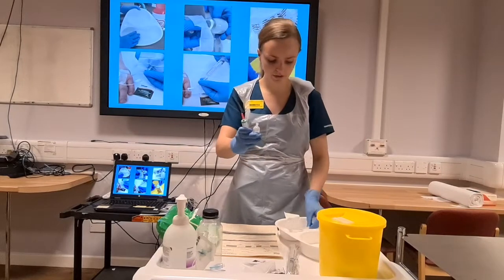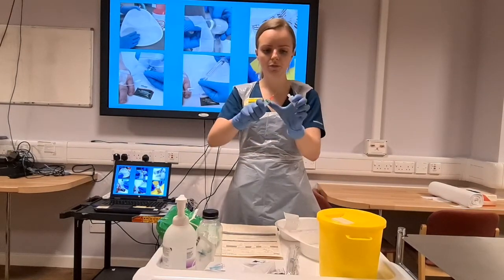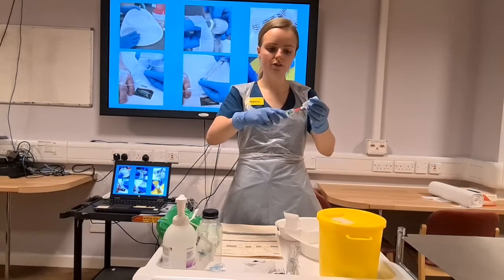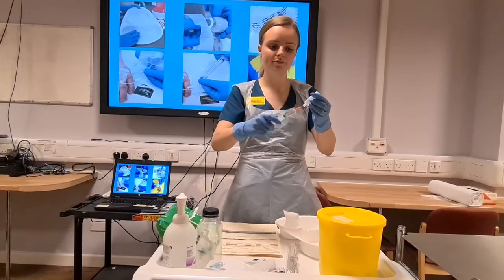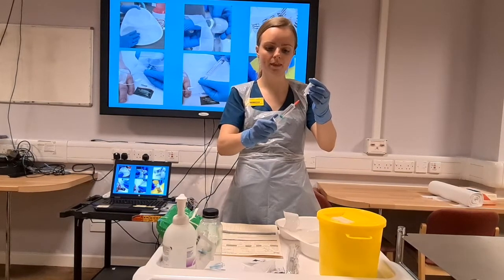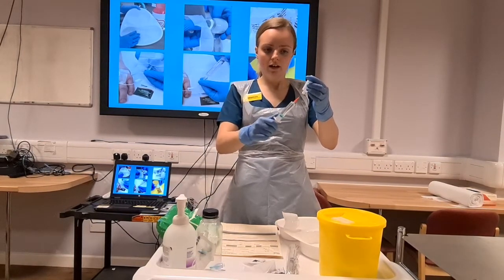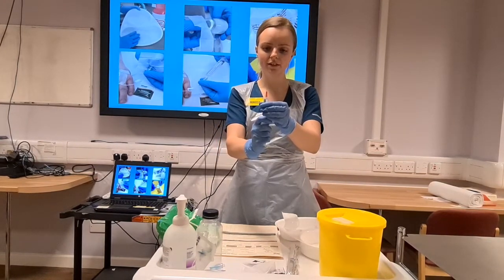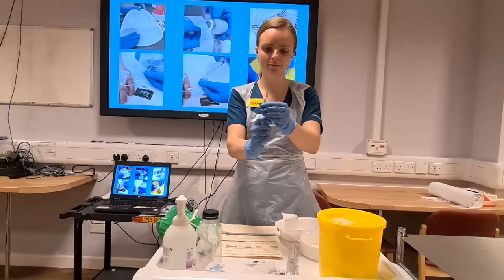Protecting my needle, getting my water for injection, and then withdrawing the amount of water for injection I need. However much, yep, that's fine. Okay, just removing the air bubble a little bit.